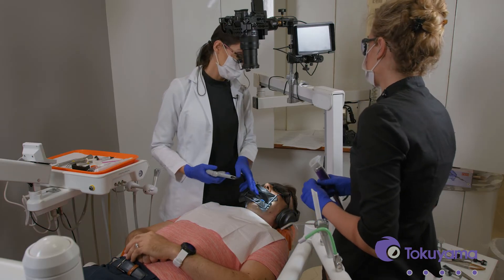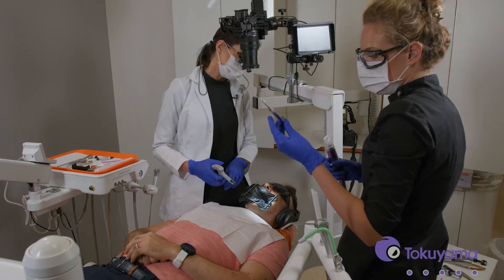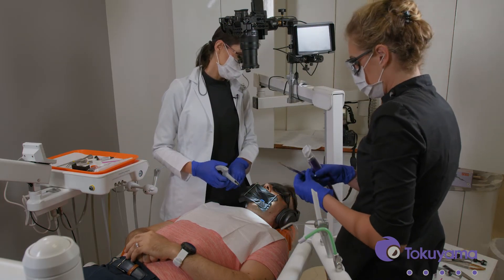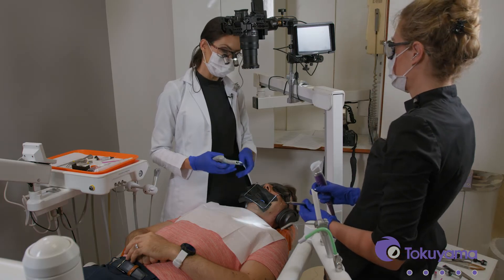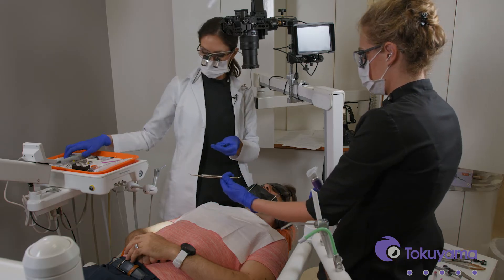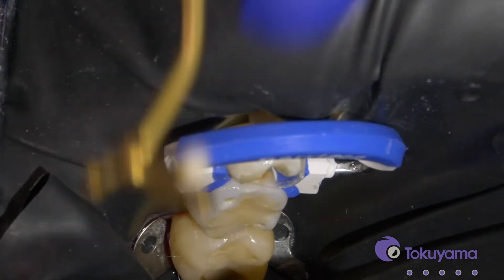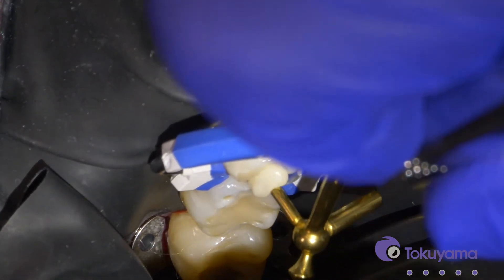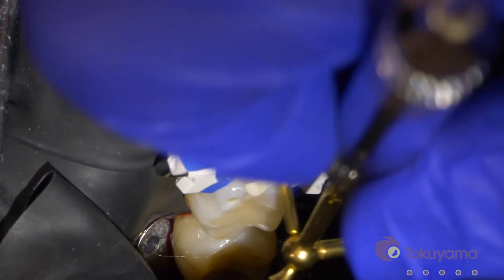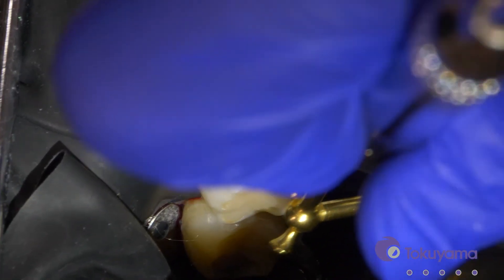And then we'll apply the composite. I like placing the flowable on the dentin and on the cavity floor first — I think it just gives a little bit more time for that hybrid layer to mature. Then we'll put the composite. I like to start by placing it at the contact area first and build that wall, just helping it spread to all the margins a little bit and create that seal.